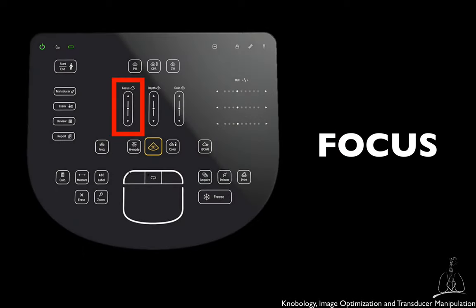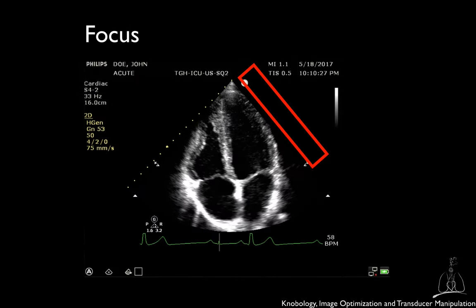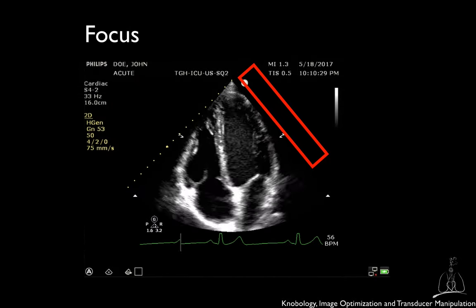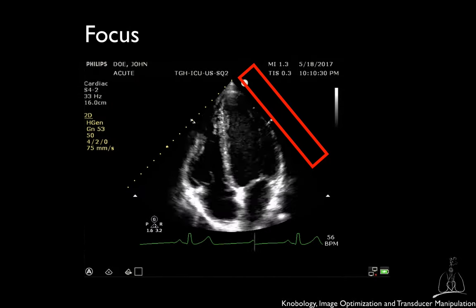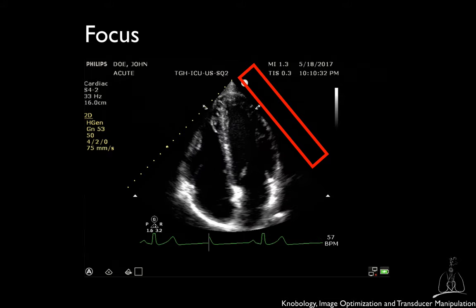The focus is also an important setting to know, as it will improve the resolution at a selected depth. Focusing allows you to concentrate the ultrasound into a narrower beam and thus improve lateral resolution. You can therefore adjust the focal depth to improve the resolution at a specific depth.